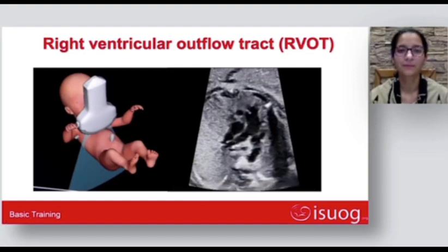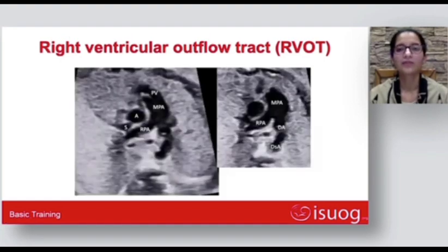as you see here. The relevant anatomy of the right ventricular outflow tract shows you the outflow tract emerging from the right ventricle, and this thin leaflet is that of the pulmonary valve. The vessel that emerges beyond the pulmonary valve would be the main pulmonary artery, and you can see the right pulmonary artery branching out from the main artery and coursing behind the aorta and the superior vena cava as it goes towards the right lung hilum. The main pulmonary artery in this view continues as the ductal arch and joins into the descending thoracic aorta.